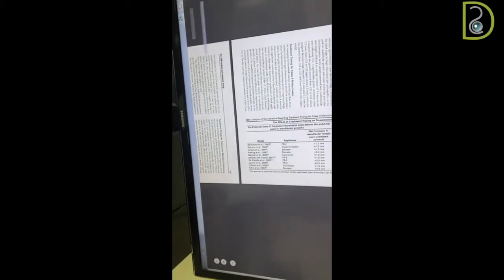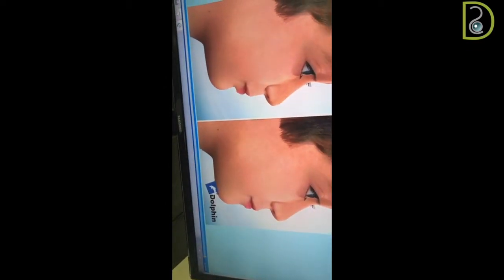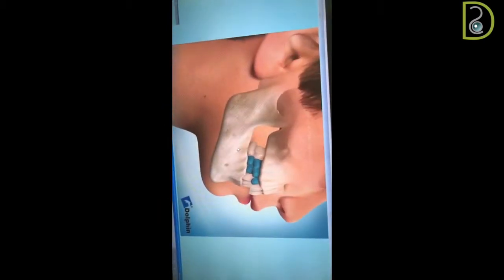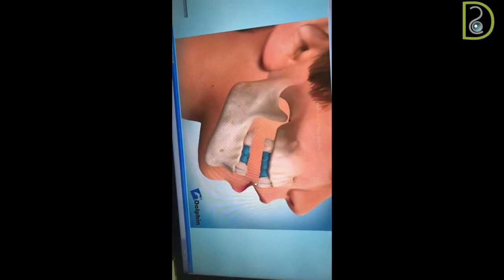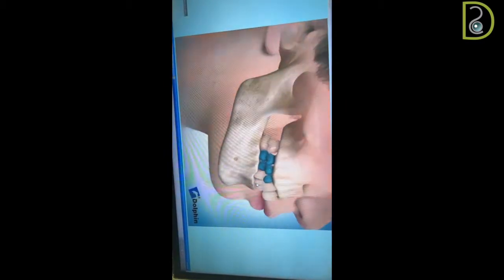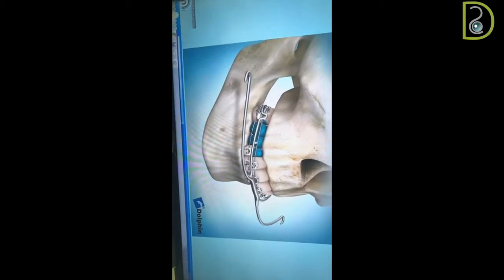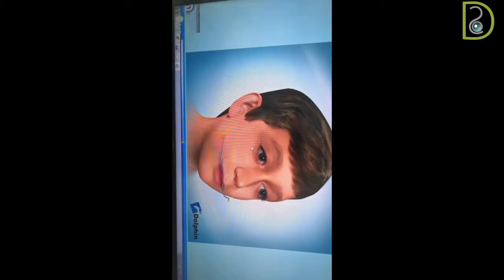So this is regarding the timing of the treatment. This is the best time. If you can see the patient at this age, this is the best time to treat class 2 cases. Now, I said in the cervical headgear when the patient has a class 2 due to prognathic maxilla. This patient has a good overbite and overjet. A good overbite, I don't need to extrude. So these cases we use headgear, but it's a combination of both.